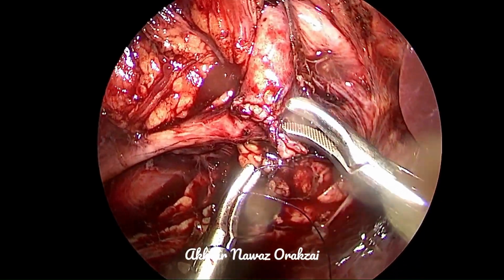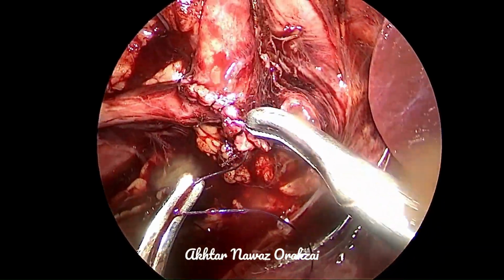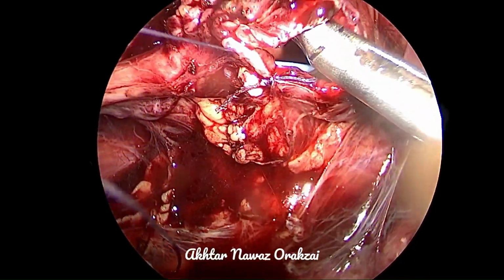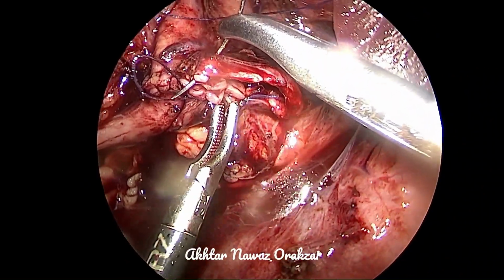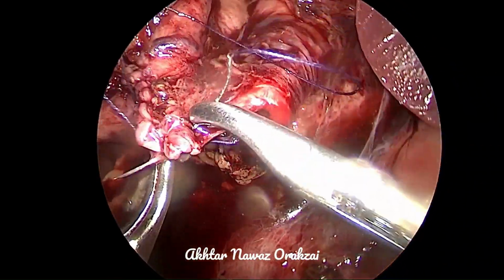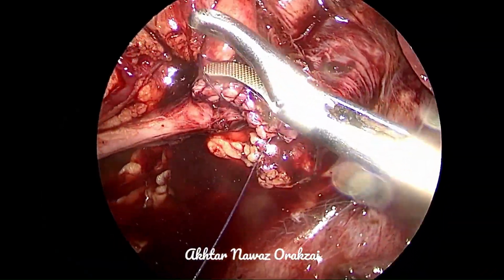This you saw, yes, this one, the longitudinal vessel and the periureteral tissue. So we were discussing the excision of the diseased segment. Here we did not resect any diseased segment.